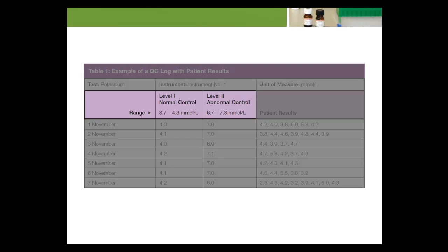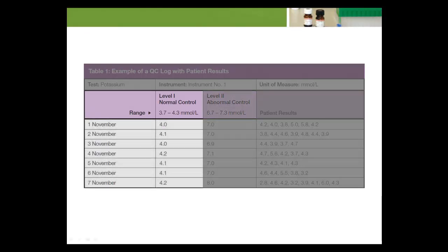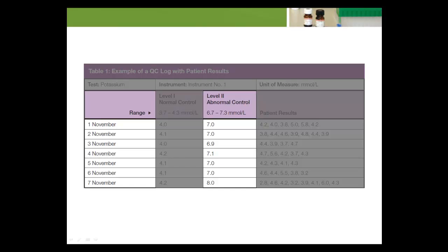In Table 1, there are two ranges reported. The acceptable range for Level 1, also referred to as the Normal Control, is 3.7 to 4.3 mmol/L. The range for Level 2, also referred to as the Abnormal Control, is 6.7 to 7.3 mmol/L. When daily QC results for the normal control are compared to the defined range, each result lies within the expected range, indicating the analytical process is in control. When the daily QC result for the abnormal control (high potassium) is compared to its defined range, the analytical process is shown to be in control for each day of testing except the last day, November 7th.